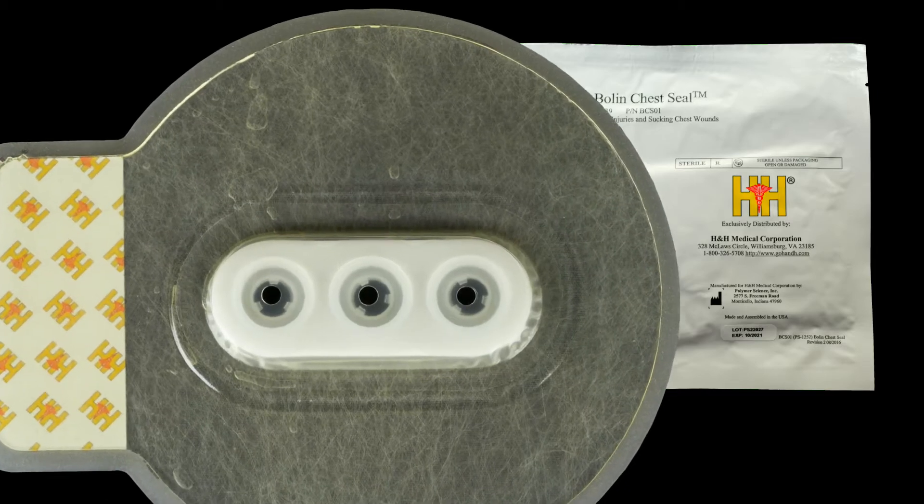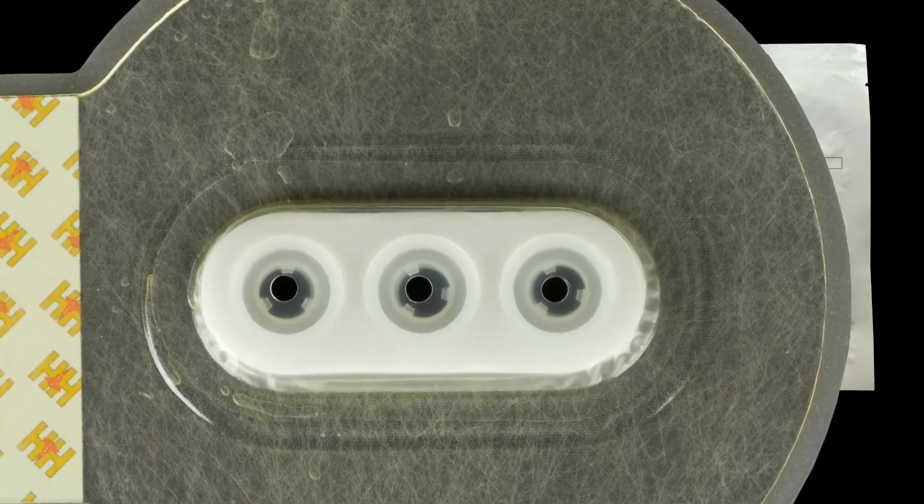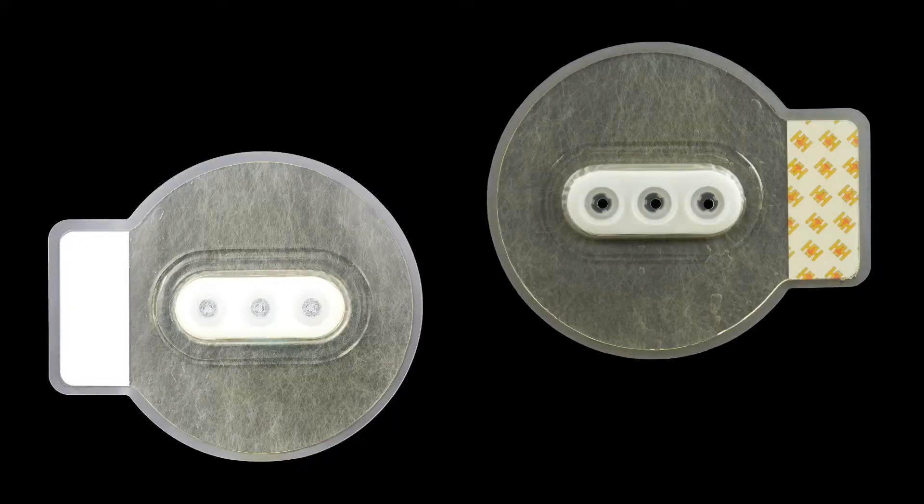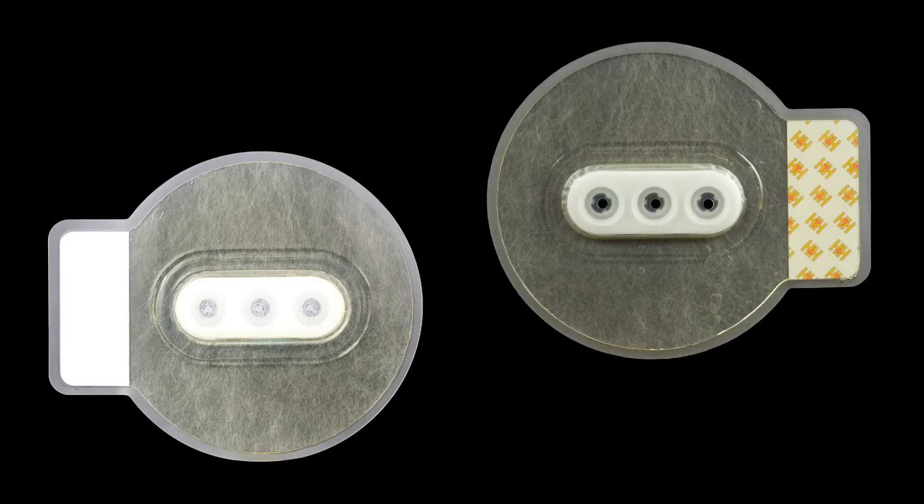The patented one-way triple valve design allows air and blood to escape while maintaining occlusion of the wound site. The Bolin Chest Seal is 6 inches in diameter, allowing it to cover even large wounds.